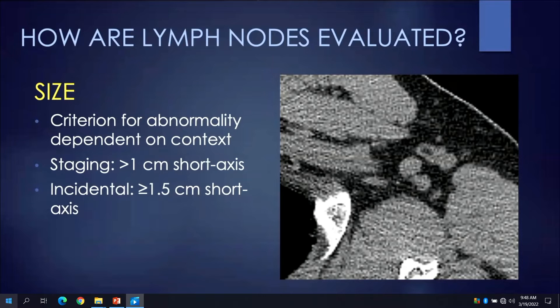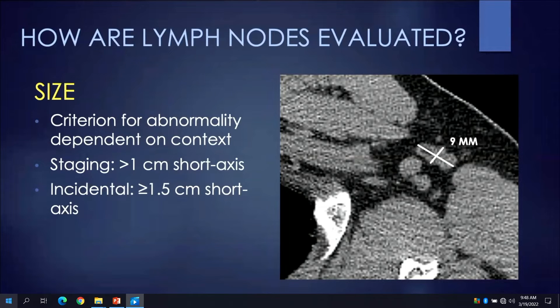How is short axis diameter measured? We identify the longest diameter of the lymph node, then measure the longest perpendicular diameter to that — defined as the short axis diameter, nine millimeters in this particular case. In patients in whom nodes are identified as an incidental finding, the size criteria for abnormality is increased to greater than or equal to 1.5 centimeters in short axis.